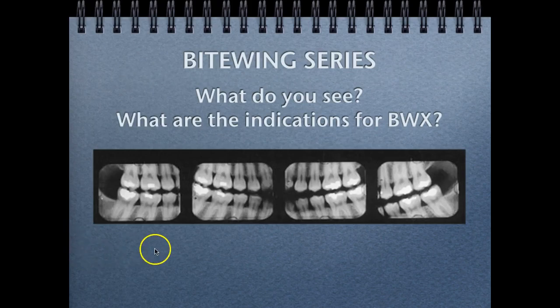So here is a set of BITEWING images or a BITEWING series, and I want you to take a few seconds to look at it and think about what do you see. So you want to recall some of your dental anatomy. Also, you want to think about what are the indications for a BITEWING X-ray series.